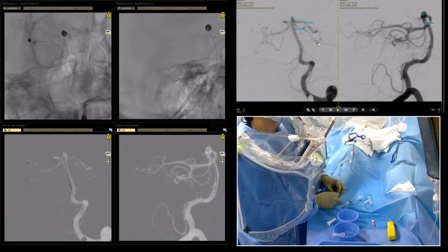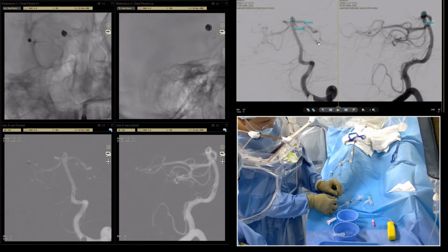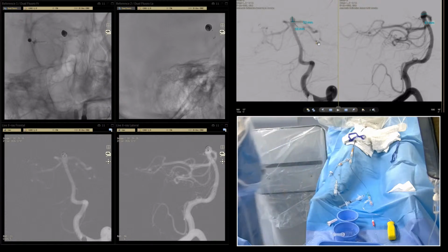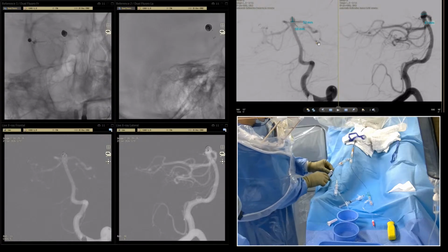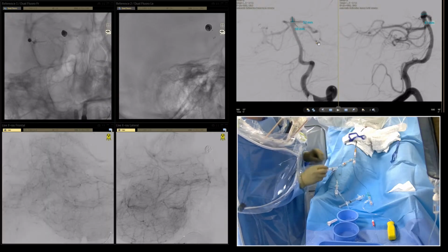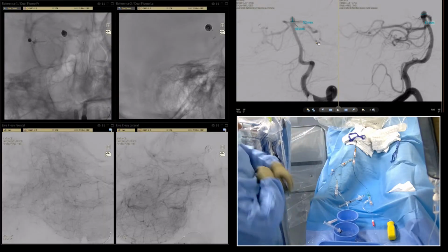This one is 2x4, which is Avenir. The company says it's a soft coil and detachment like this, just between two black points. We broke the coil and detach. Okay, let's do it. It looks like there is a place for a couple of coils. There is still place, huh?